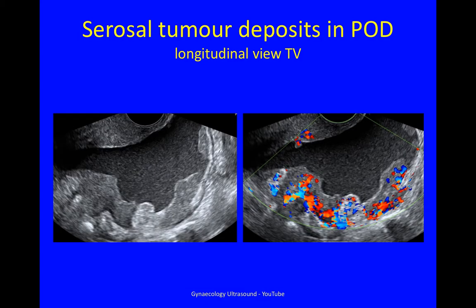This is a transvaginal view of the pouch of Douglas. Here you can see the cloudy ascites and irregular tumour deposits in the serosa, which are strongly vascular.